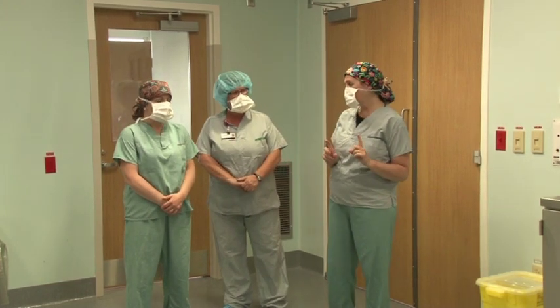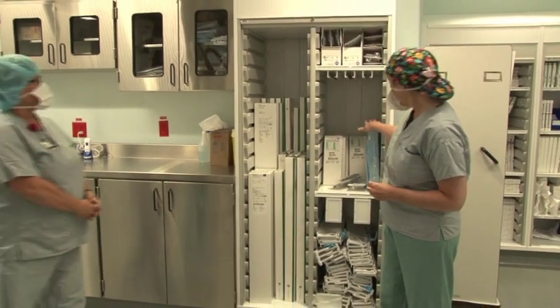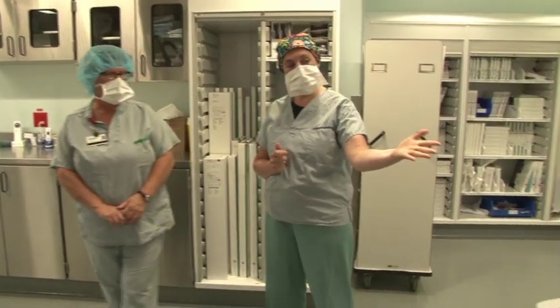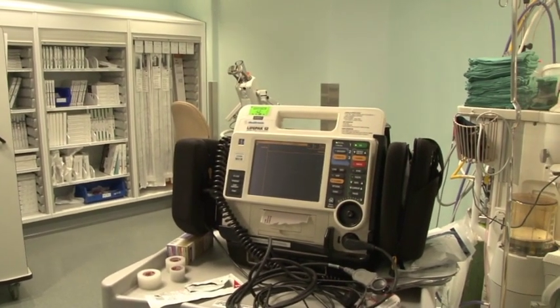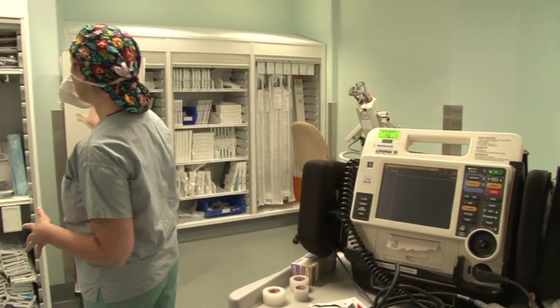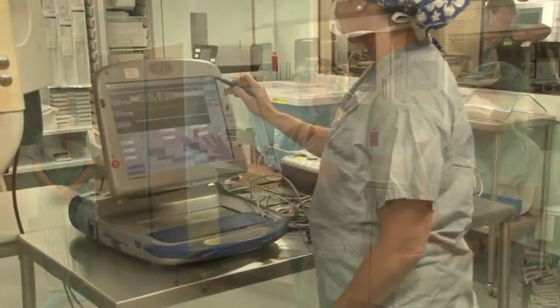I just want to point out a couple of things with our emergency equipment. So along here, we keep, in case we ever had to do a pericardial tap or a chest tube, emergency trays, things like that here in the room. Our defibrillator is here. All patients are hooked up hands-free to the defibrillator, and also with the 3-lead ECG. So those are important things for this side of the room. As I said, for electrophysiology studies, all of our supplies and things are kept on this side of the room with extra supplies. Moving down towards the foot of the bed, this is where we keep our analyzer.